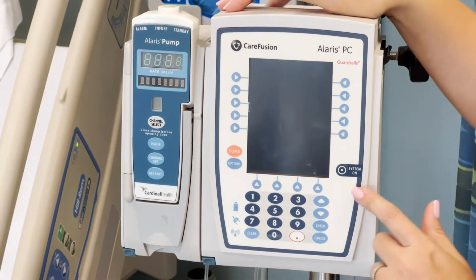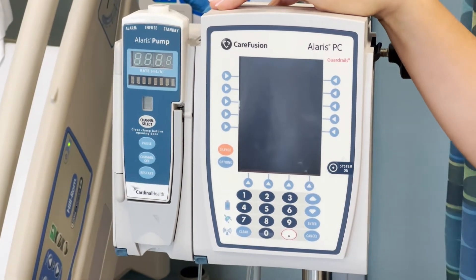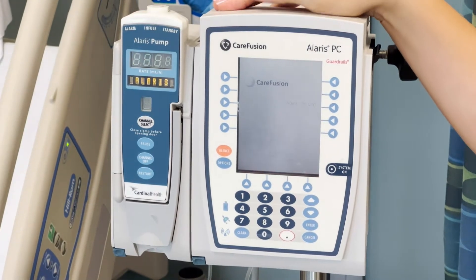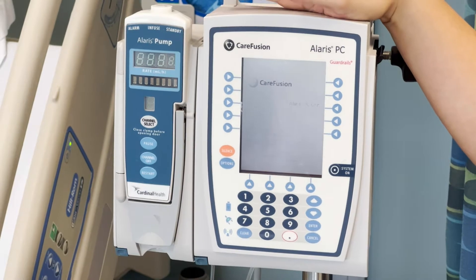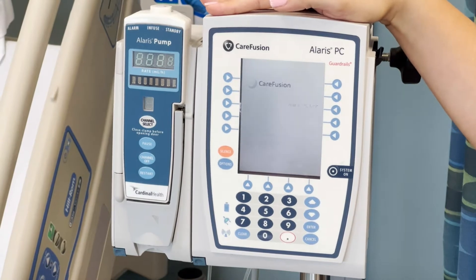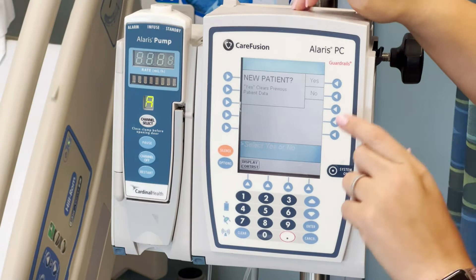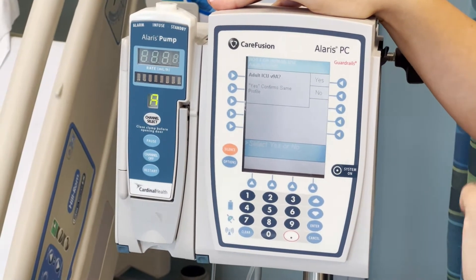To turn it on, go ahead and push system on. First, it will ask you if it's a new patient. Some hospitals have a barcode system where you can scan your patient's information right into it. If not, follow your hospital policy to figure out how to put your patient's information in. I'm going to say no just for our practice.